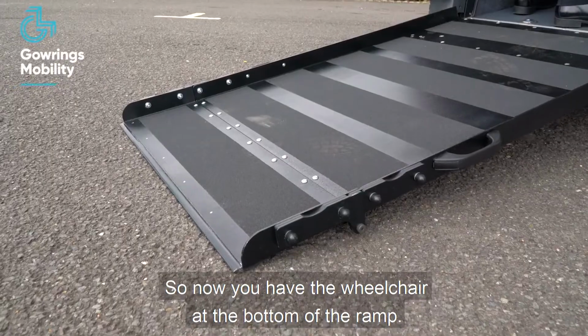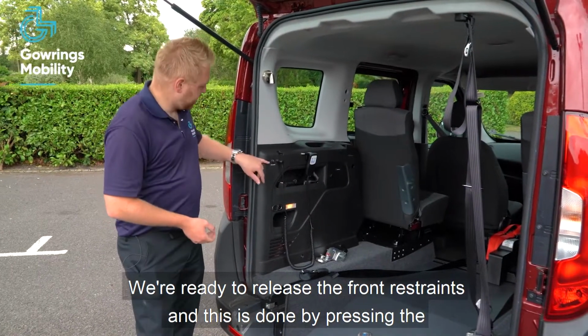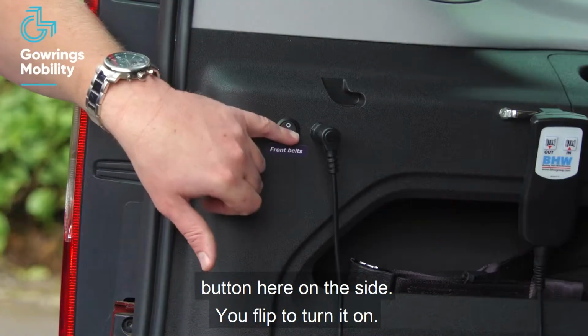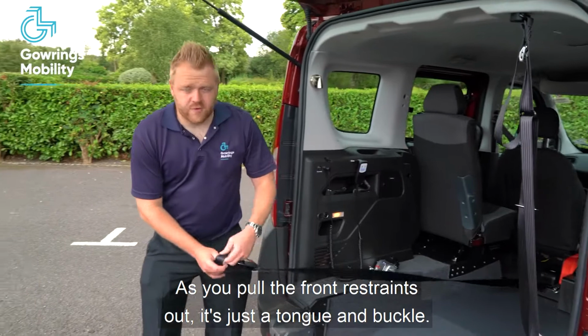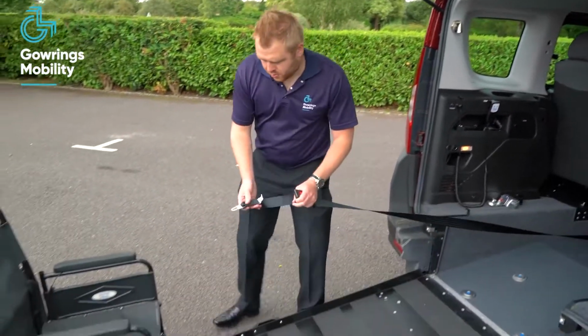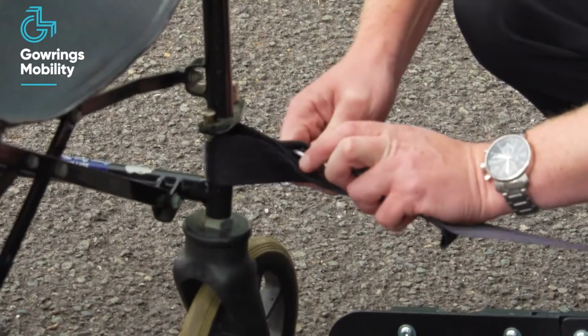So now you have the wheelchair at the bottom of the ramp, we're ready to release the front restraints. And this is done by the button here on the side. You flick to turn it on. As you pull the front restraints out, it's just a tongue and buckle, and the tongue goes around the anchor point of the chair and clips straight in.